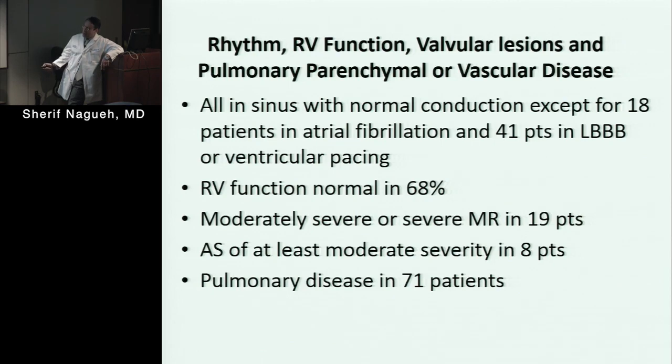The ones that are challenging, pulmonary disease is going to be a big issue. So let us look at how it performed there. I understand, but how do you diagnose pulmonary disease? That was diagnosed based on review of their medical records and PFTs and cardiac catheterization to identify those with type 1 pulmonary hypertension. So that was available. Now, why were they included? The investigators felt that not excluding anyone for these reasons would be good. We can do the analysis with and without these cases since they are small, and that will be presented.